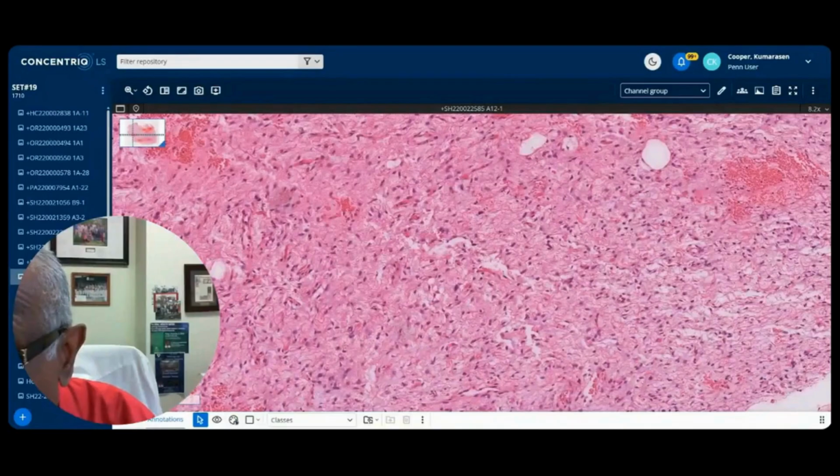And then, of course, given the location of retroperitoneum, Rohan, I think that Rohan, MDM2 and DDIT, I like all of those. So Jan said myxoid well-diff liposarcoma versus D-diff, given the location. Correct. So these are all good answers, and these are all good differential diagnoses for the discussion point.